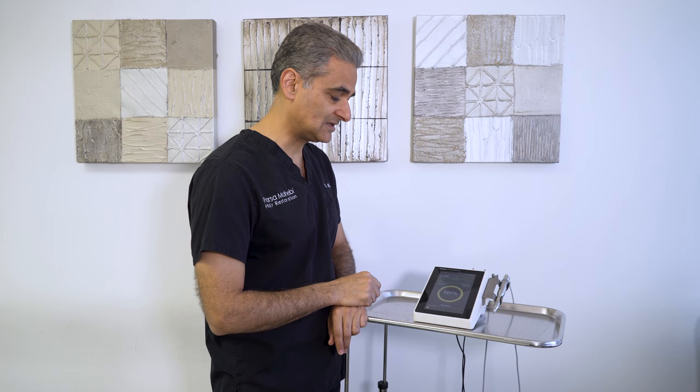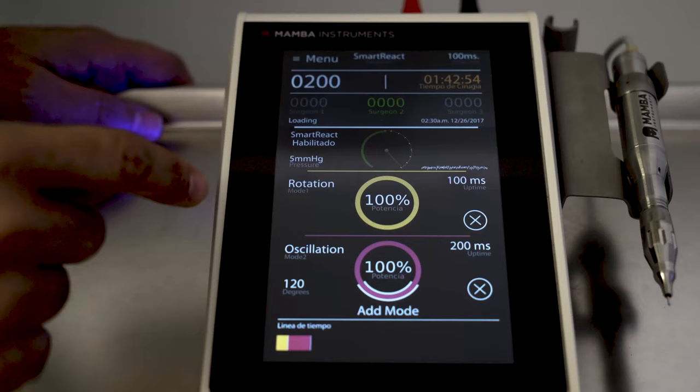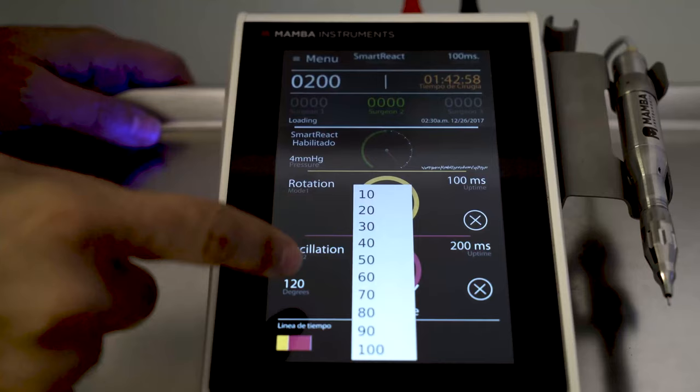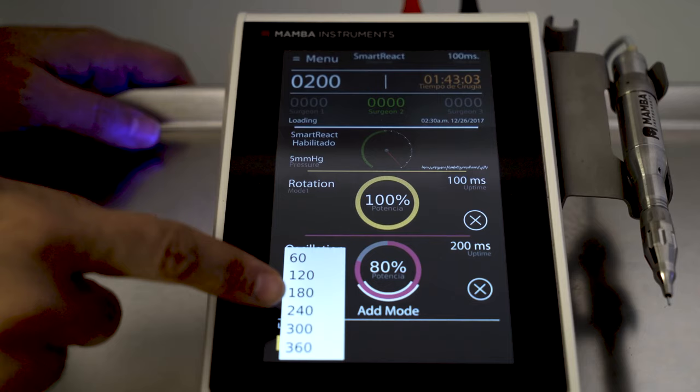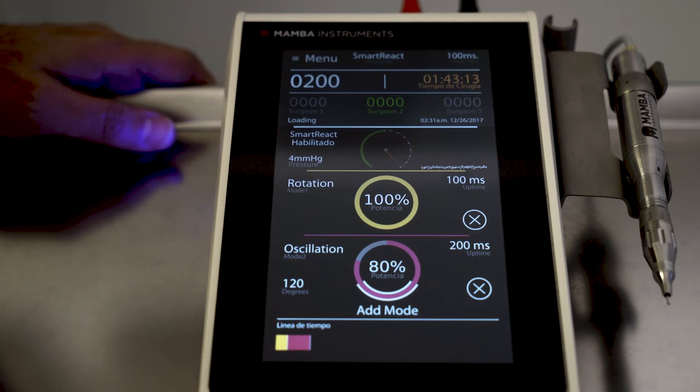The lower layer is loose fat, and I don't want to use sharp rotation there because the deeper I go, the higher the chance of transection damage. So I add a mode — my next mode will be oscillation at 80% engine speed. I change the degree of oscillation to 120 degrees, so it goes 120 degrees back and forth.